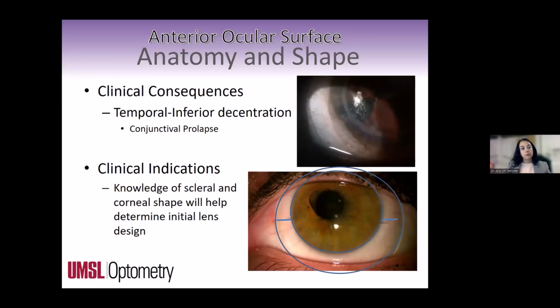So we need to tighten up that periphery all the way around in your two meridians, so that you could get that to be centered up better. And then you're going to be able to dispense that type of lens after you get it centered better, and then decide if you need to make any more modifications beyond that. But 100% you would want to tighten this periphery here.